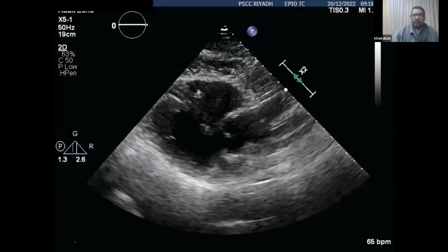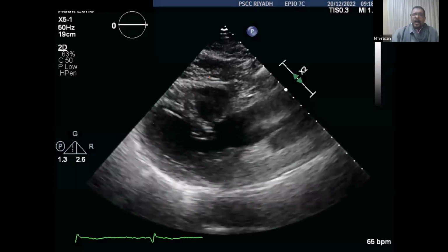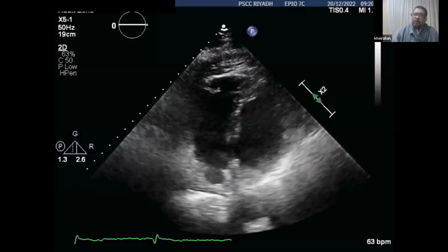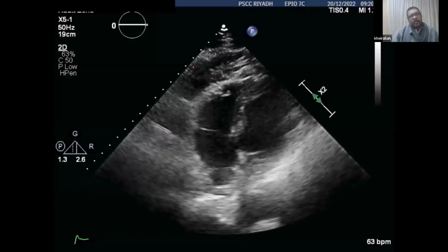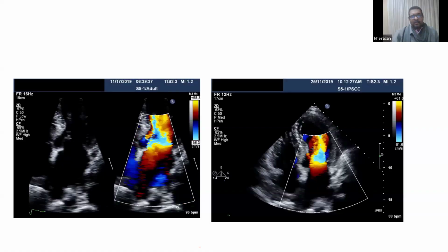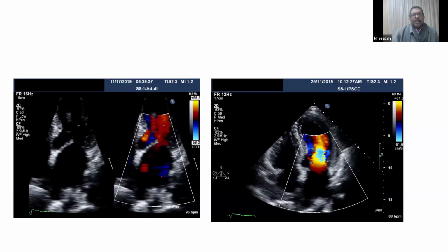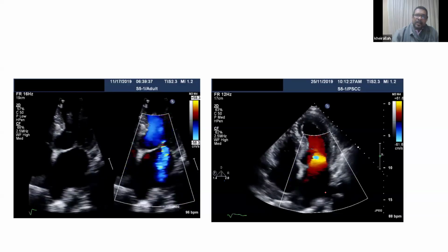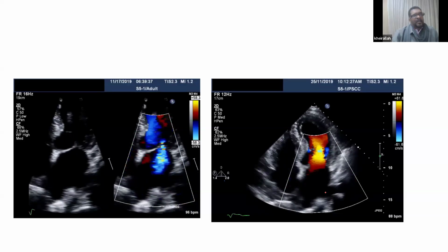Okay, I'm going to skip these things. Back to this one, you see this is fat, okay? These are all fat. See how thick this fat is? It looks like having a tumor around the heart. This is fat. Now look at this MR. This is MR for this patient. This is MR for the same patient after something was done to this patient.